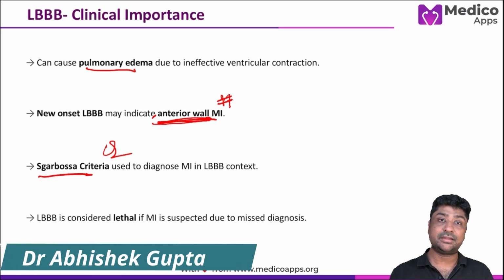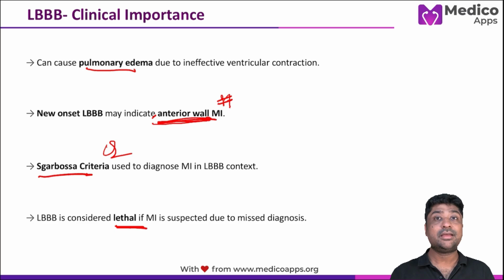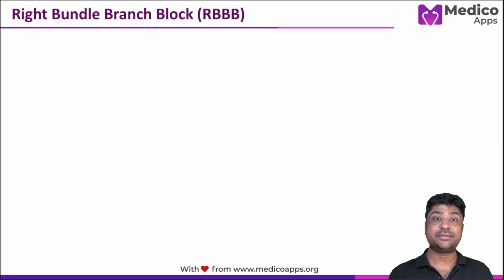And finally, LBBB is considered lethal if missed in MI. If a myocardial infarction is present but misdiagnosed due to the conduction block, treatment gets delayed and outcomes worsen dramatically. Always think of MI first when LBBB is new and the patient is symptomatic.